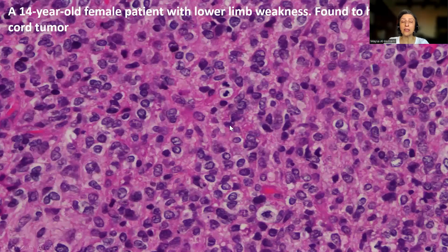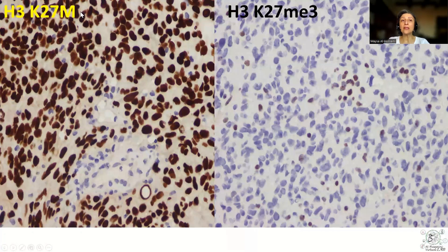Let's put this into context. This is a spinal cord tumor in a 14-year-old female patient, and it is a high-grade glioma. We have to specify whether this is consistent with diffuse midline glioma or not. The H3K27M shows positive nuclear staining in the tumor cells in the presence of a negative internal control, supporting that this is the mutant tumor. The trimethylation shows negative nuclear staining in the tumor cells in the presence of a positive internal control — either residual glial cells or endothelial cells.